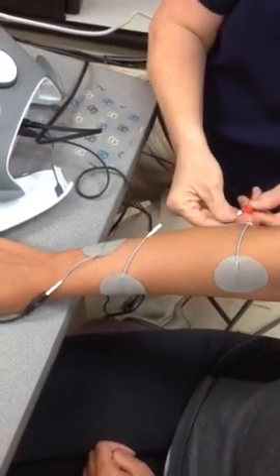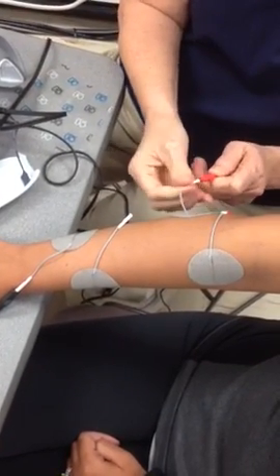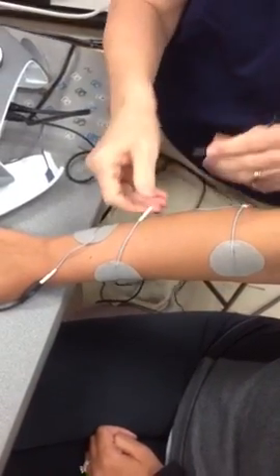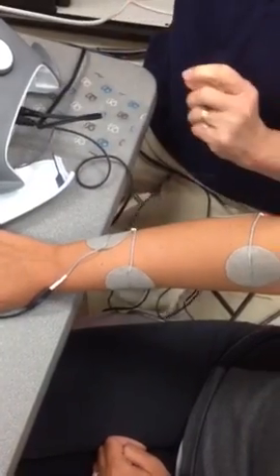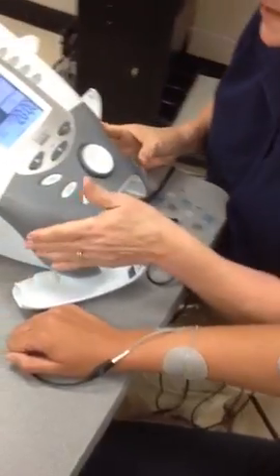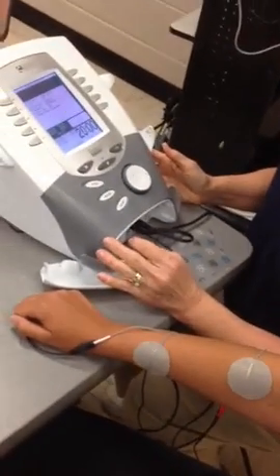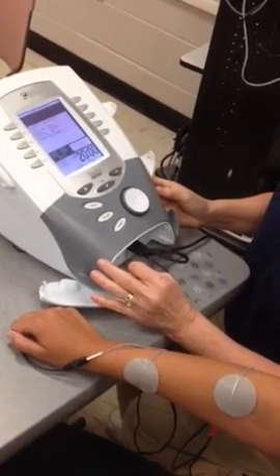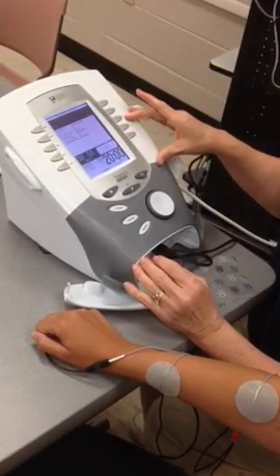All right, so remember, the closer together your electrodes, the stronger the signal and electricity. All right, so now we've got all the electrodes attached, and this is not for stimulating muscle contraction, this is more for interference with pain.